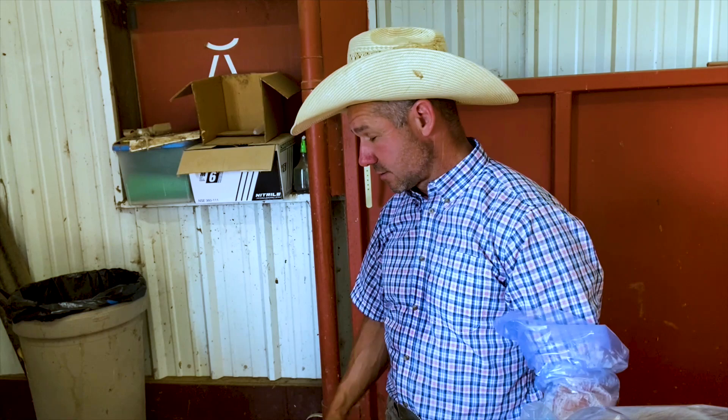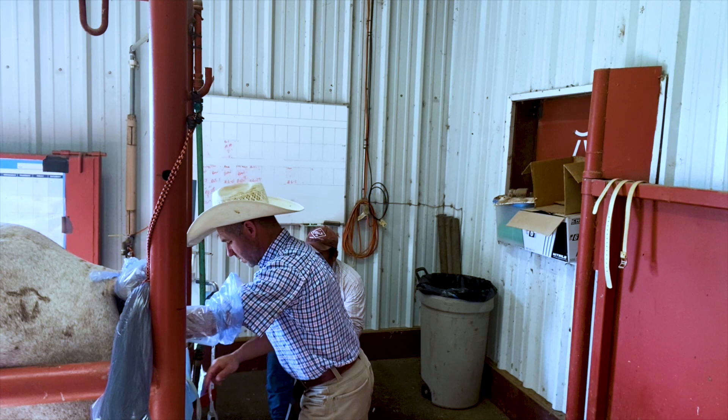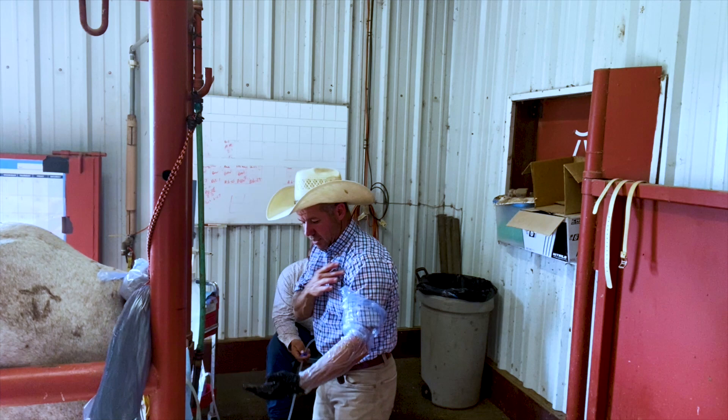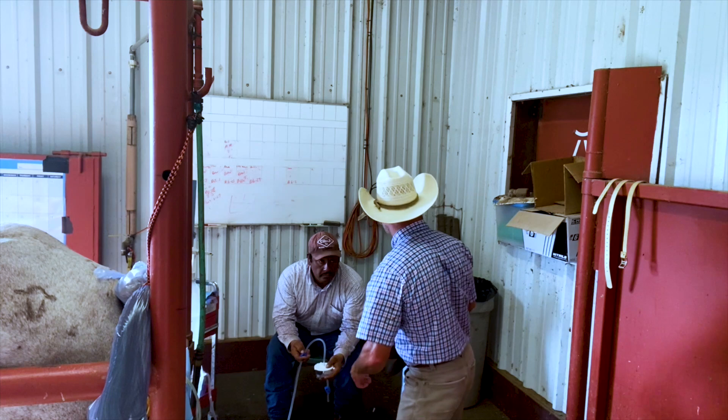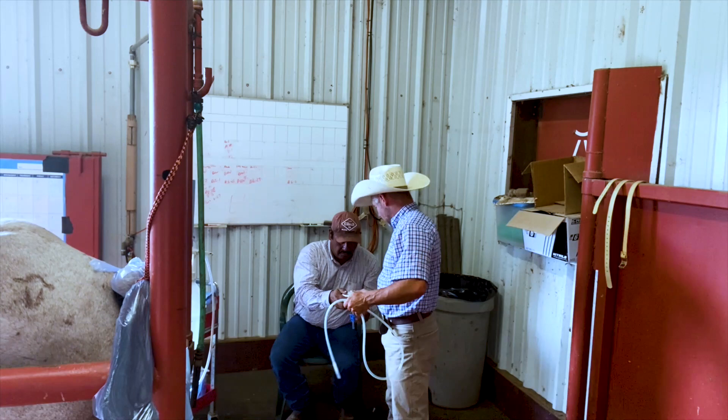Round four, the last one. Once we're all done and get the uterus completely drained, we'll be done with this part, and once we get an embryo we'll move to the recipient mare. It's going smooth. This is the last flush — before we start I'm going to go in there and lavage the uterus, make sure I've got fluid all the way up and down all the horns. I just worked it and milked the horns out. Now we've got to take the air out of the catheter and drain the hose. All right, let's go see if we've got an embryo.